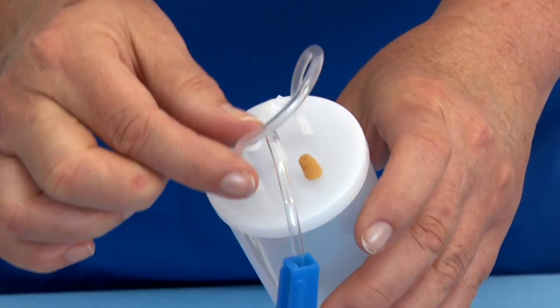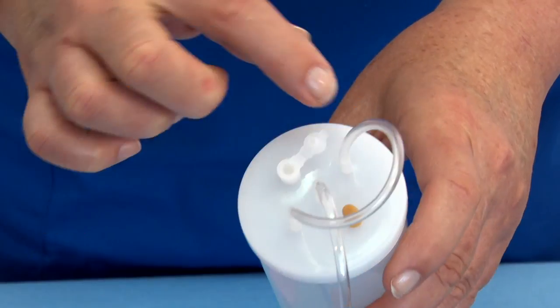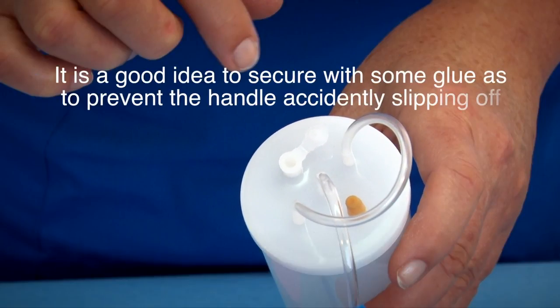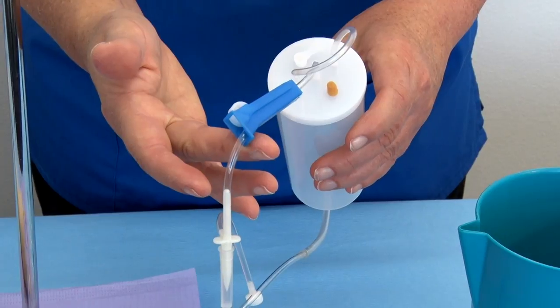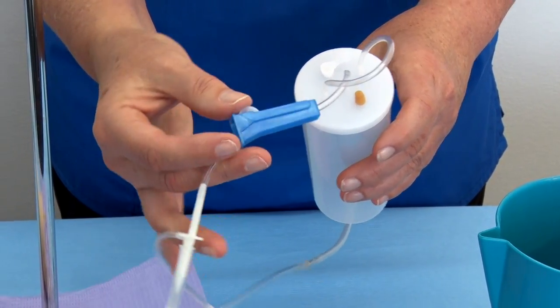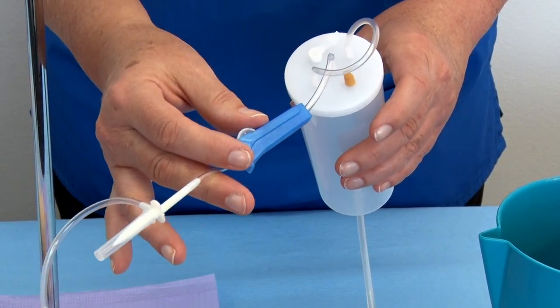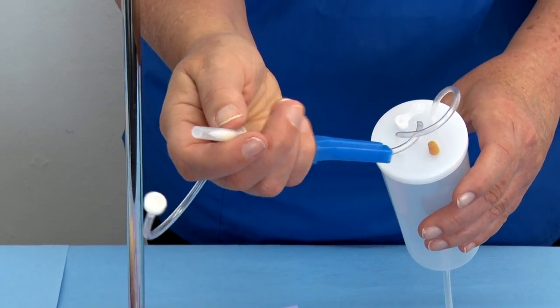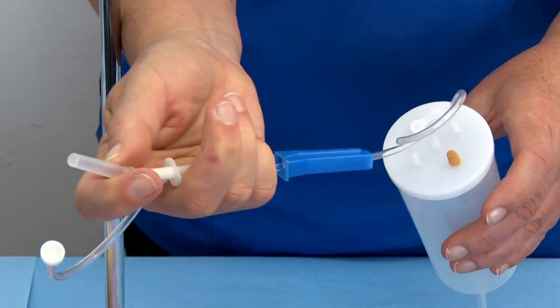Step 8: If not pre-assembled, attach the handle of the container by pushing it over the two plastic posts on the container lid. It is a good idea to secure it with some glue to prevent the handle accidentally slipping off. The reservoir container has a lid with an inflow tube for connecting an IV bag if desired — this is neither essential nor necessary, and an IV bag is not supplied in the box.